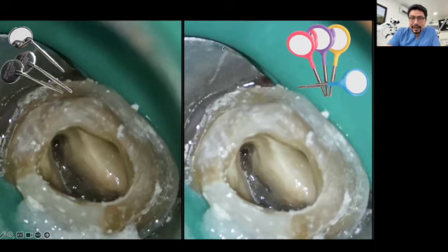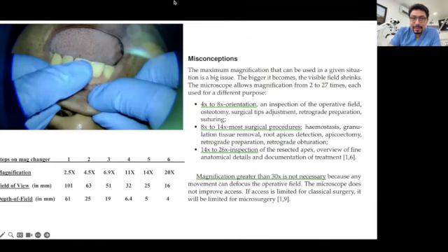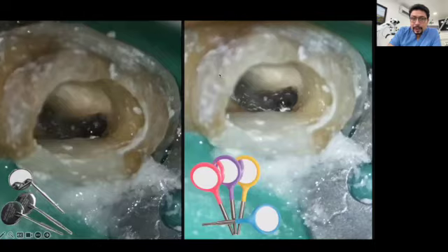The brand of those mirrors is, let me see, and I can type it in the chat. These are Cirque mirrors. Cirque is not paying me for saying this. I just believe that these mirrors are some of the best in the market nowadays. Let me go back.